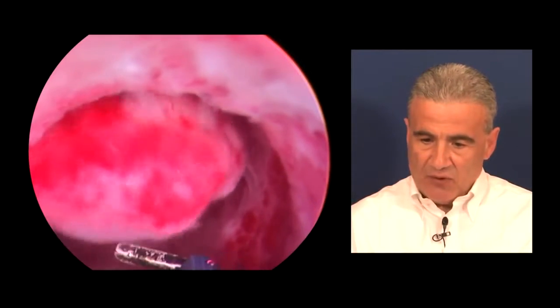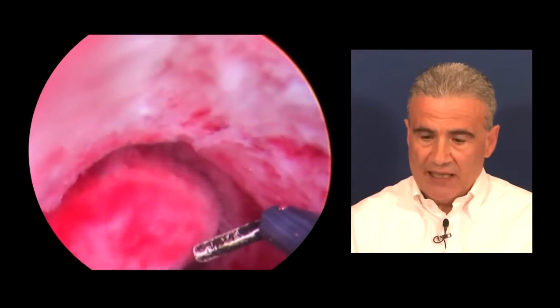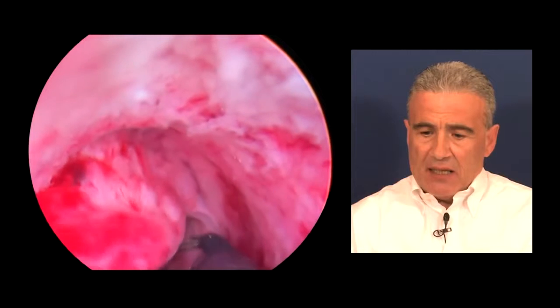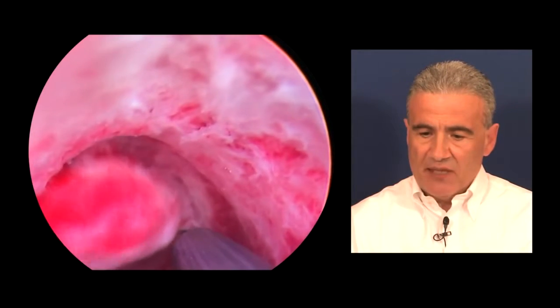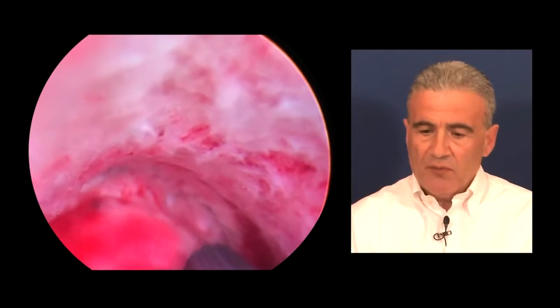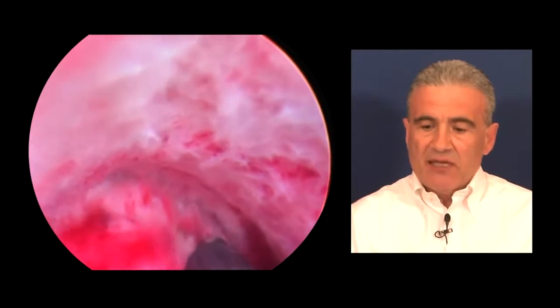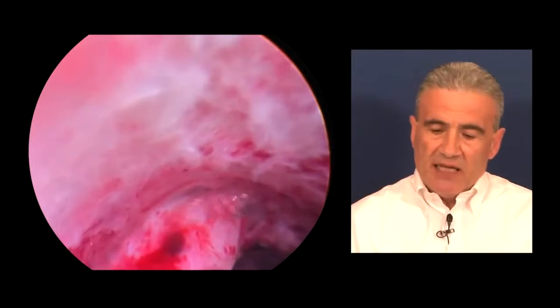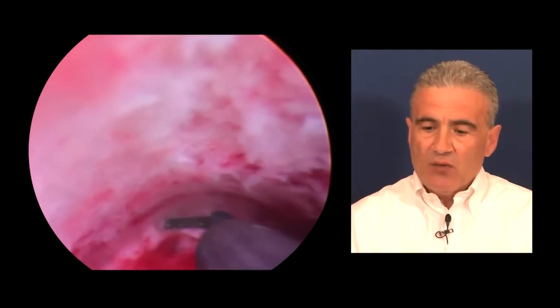We can observe the polypoidal neoformation, and we see how it is initially attacked by the monopolar electrode, with which the base of the polyp is gradually sectioned so that it can remain completely intact. It does not have to be fragmented in several segments, since due to its dimensions, it can be extracted entirely through the operating channel with the sheath of the instrument.